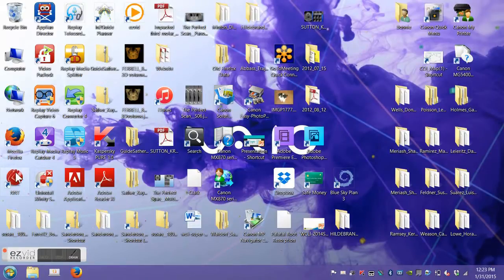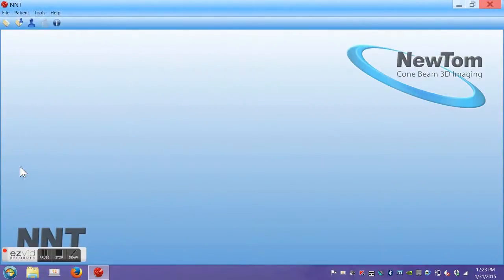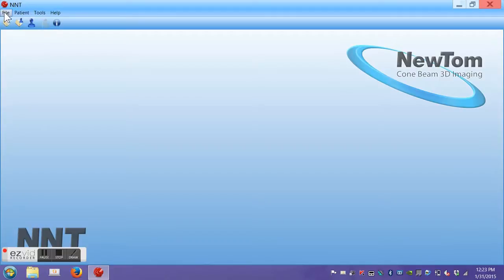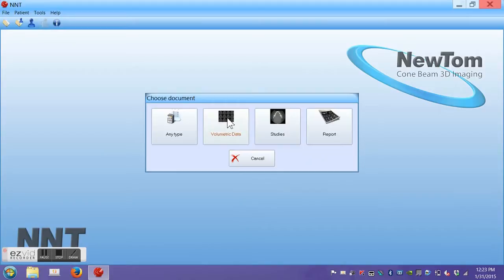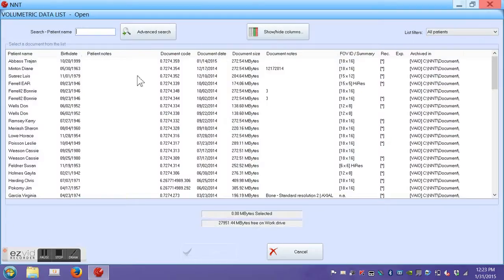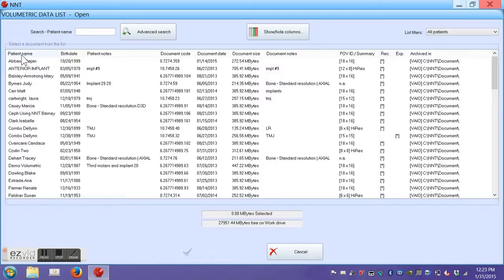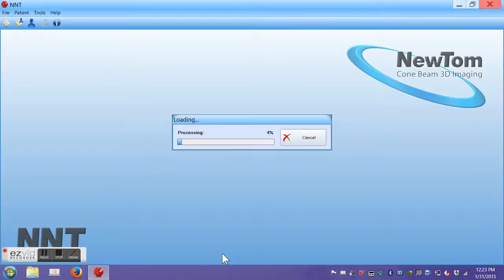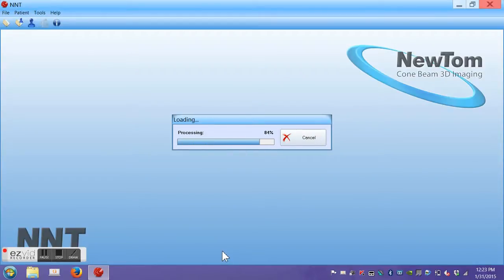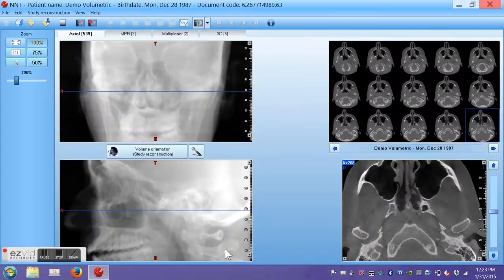We begin by opening NNT software with a double click from the icon on your desktop. The NNT screen opens. Click on File, then click on Open by Document, then click on Volumetric Data. In order to alphabetize your list, click Patient Name and then select the patient you want to study. The software loads the data and the initial screen opens.